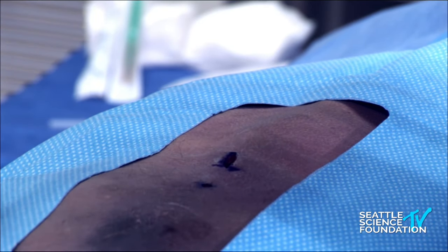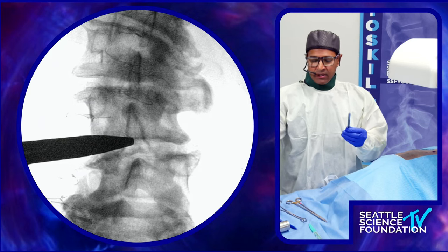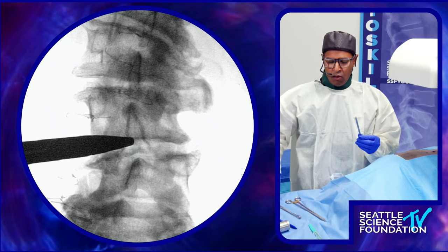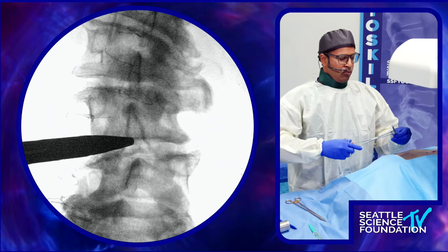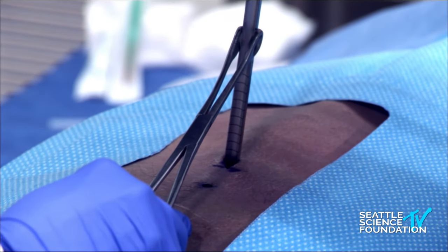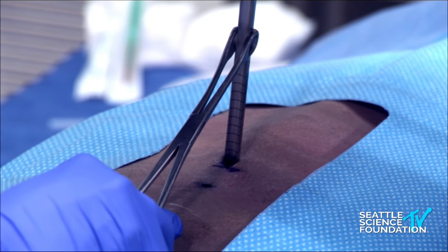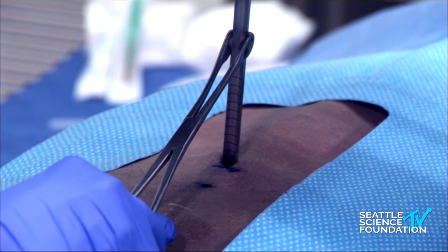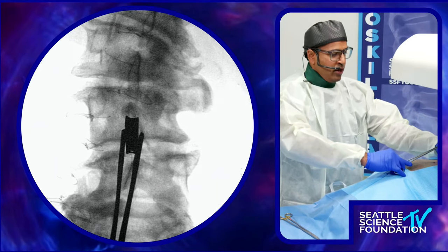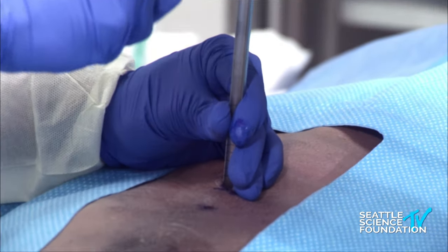I take the first instrument, which is dilator one. It sometimes comes with a cap — I take the cap off personally because I like to mallet it directly on the metal; it gives me more fidelity on what I'm malleting rather than hitting a plastic top. The most important part of the procedure is making sure dilator one is right in between. With my left hand I hold dilator one and I mallet.